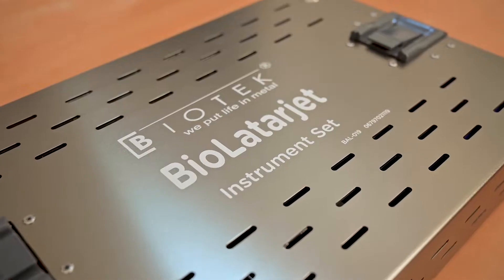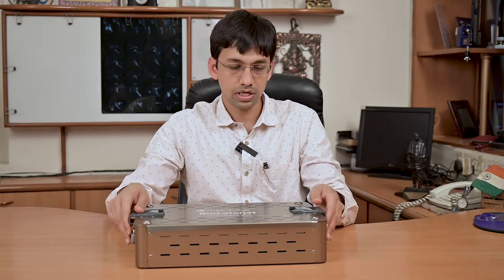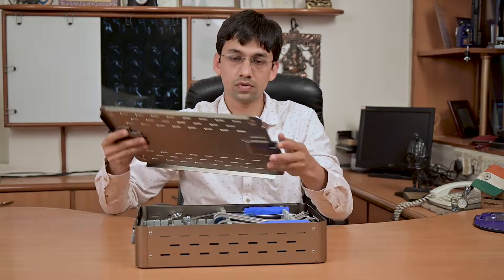Hello, I am Dr. Ruhan Vakta, orthopedic surgeon, sports and ligament injury specialist from Ahmedabad, Gujarat. Today we are going to see the Bio Latarjet set from Biotek for doing Latarjet surgery. Let's see all the instruments one by one.